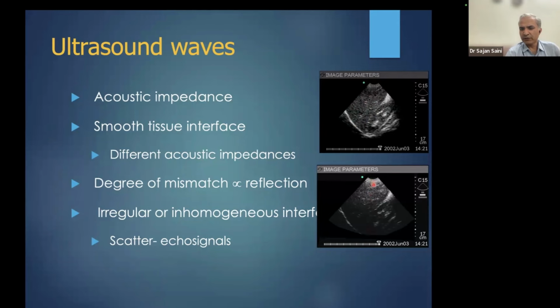They encounter some tissues here. Some of them get reflected, some get refracted, some get transmitted. So we can understand that some get scattered here, some get scattered here. As these waves penetrate down and down, there is a loss of signal, and this is known as attenuation. So you get all black signals because very few signals reach the bottom as you penetrate deeper and deeper inside the tissues. There are ways to overcome that. We'll discuss them shortly.